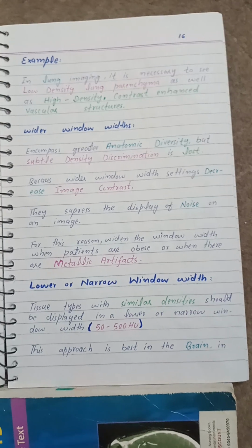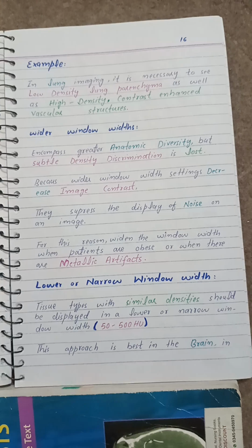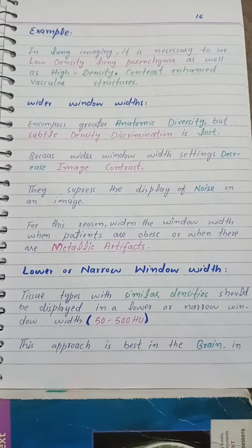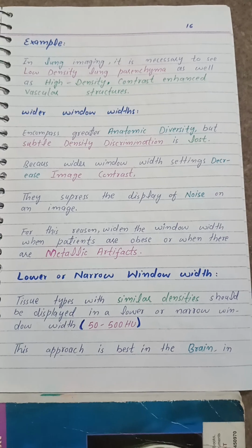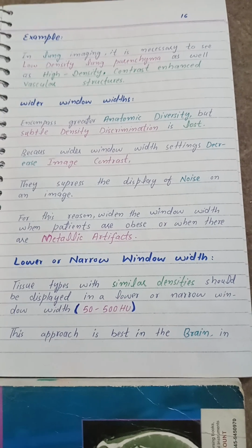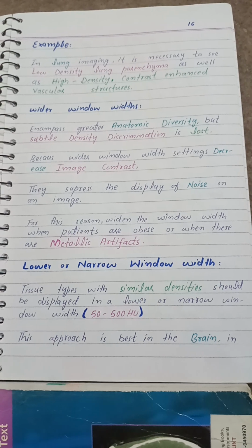A wider window width encompasses greater anatomic diversity, but subtle density discrimination is lost. Because a wider window width setting decreases image contrast, this suppresses the display of noise on an image. For this reason, use a wider window width when patients are obese or when there are metallic artifacts.